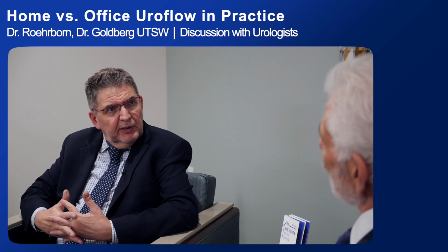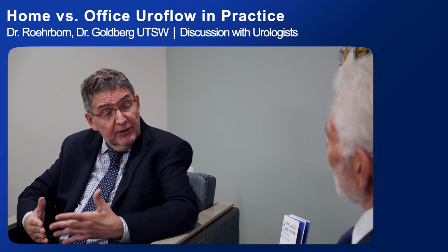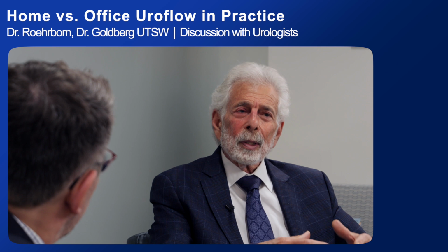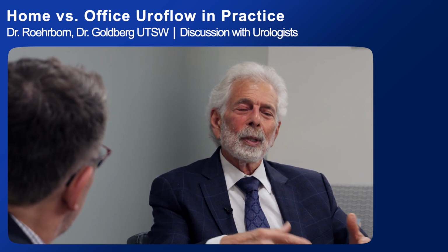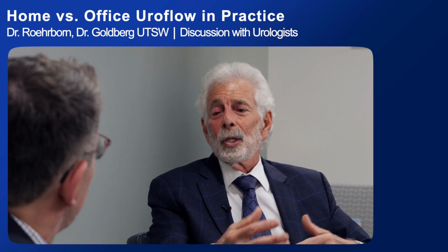So let's dissect a little bit. The guidelines really only state the initial evaluation. That's sort of the dilemma of all the guidelines, really. But that's not all we do. We have patients on active surveillance or watchful waiting. And so do you use it there to monitor how they progress? More so at the current time only when there's a change, because there's an expense. We'll get into some of the issues about office flowmetry. So not really unless there's a change.